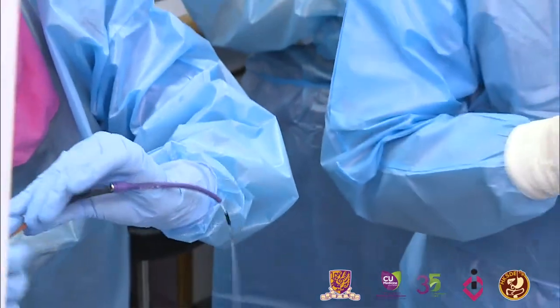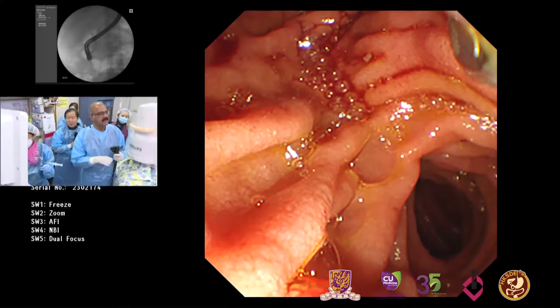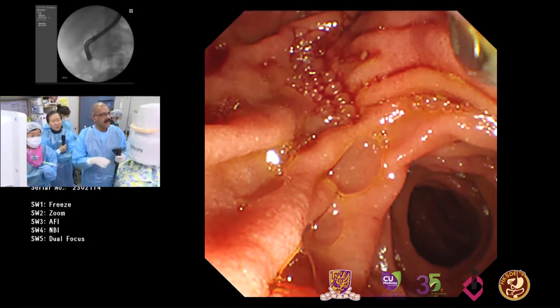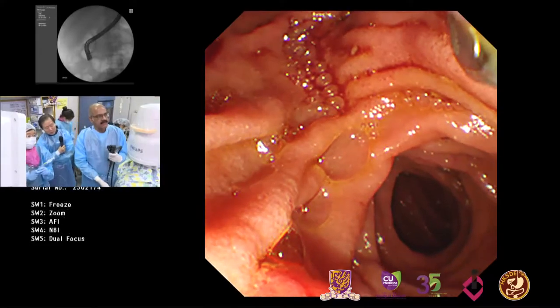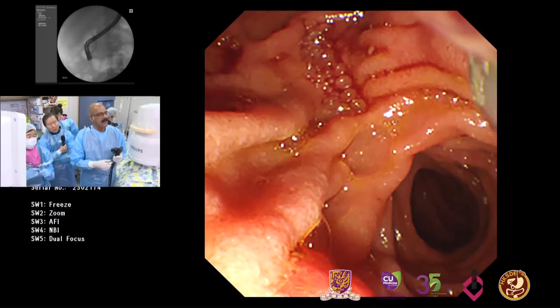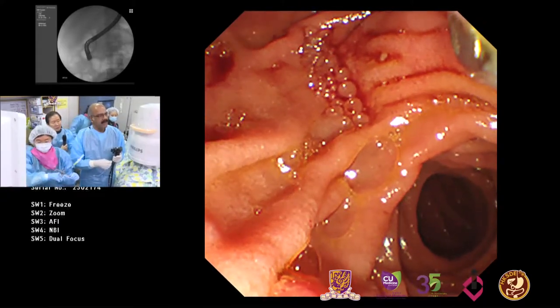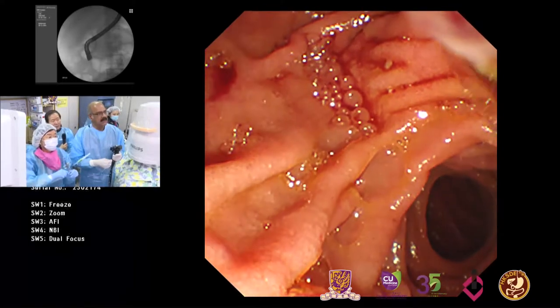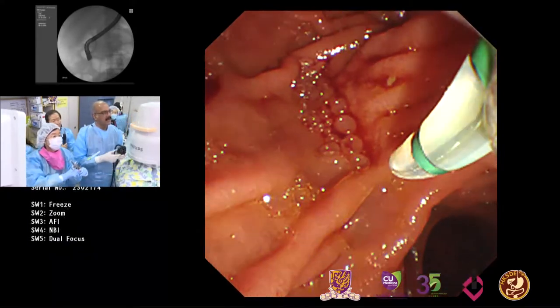I have my elevator up, and you can see my body is turning towards the right here so that the scope doesn't slip out. But we'll have to keep that position constantly, and I have a feeling that the scope may slip sometime. So I'm also trying to adjust fluoroscopically, and now I'm going to get in there. With the elevator up, when the sphincterotome comes to the edge of the scope, I lift the sphincterotome up, and then I'm going to get closer.